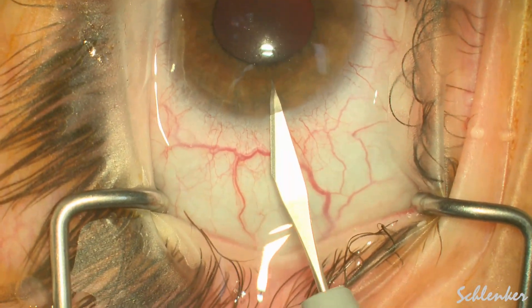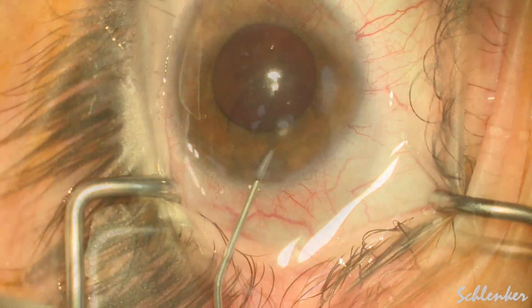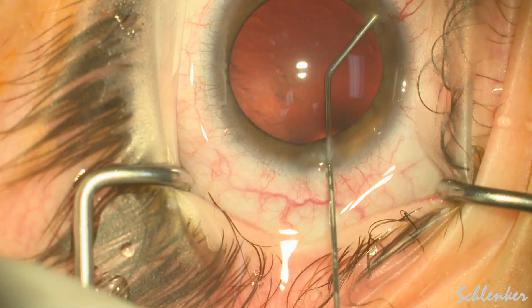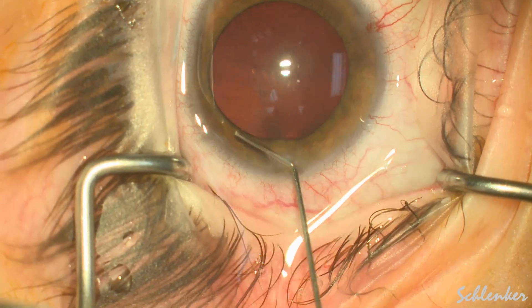Here I am making a paracentesis using a 27-gauge needle by the 5-0 prolene, and then just used a 15-degree blade for a main incision, some preservative-free lidocaine, followed by some cohesive viscoelastic.